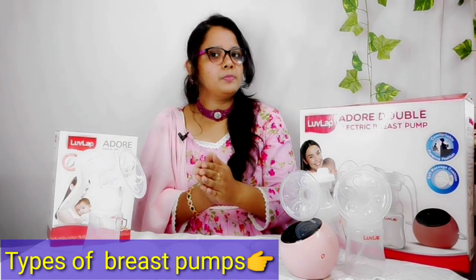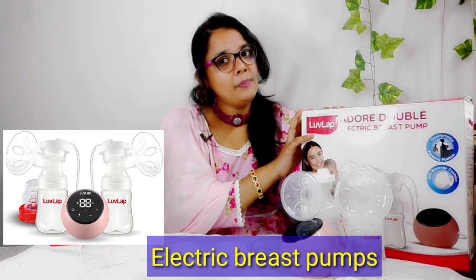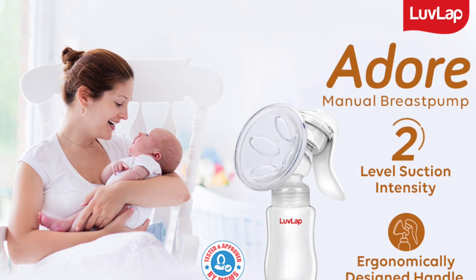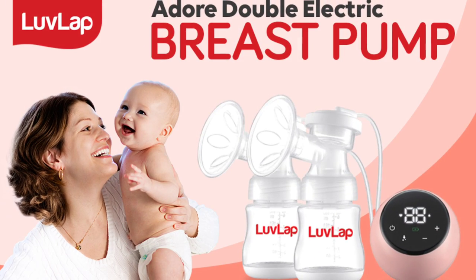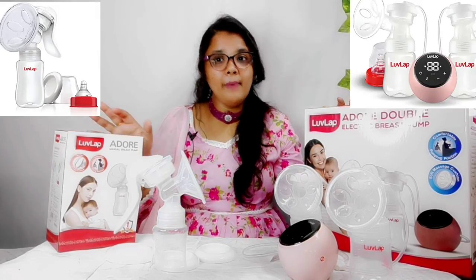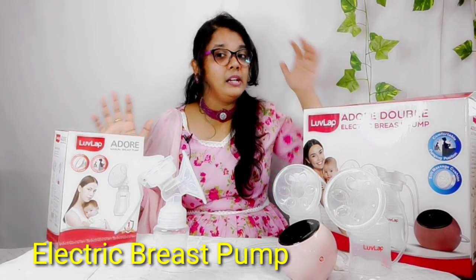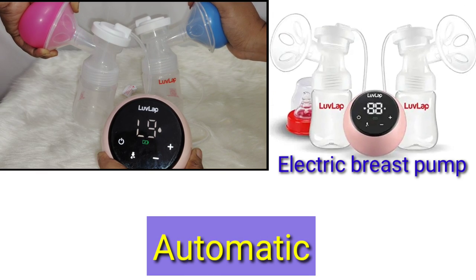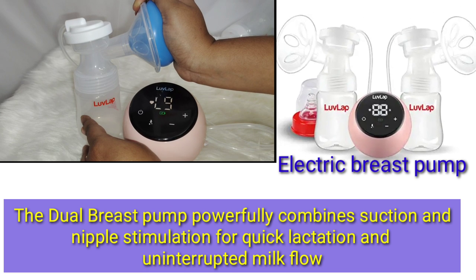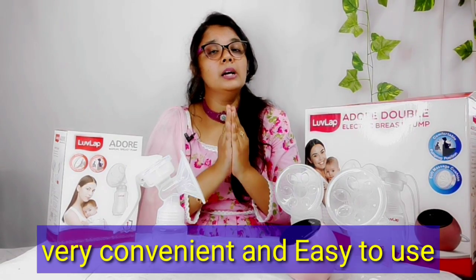There are two types of breast pumps: a manual type and an electric type. In this video I will share a complete review and information on both. The electric breast pump provides uninterrupted milk flow, combining suction and nipple stimulation. It is a bit quicker than the manual type.